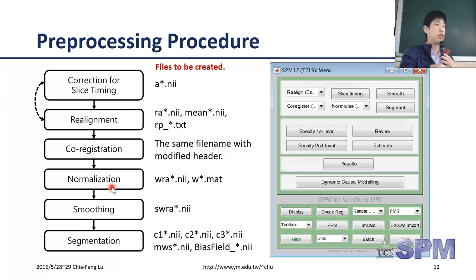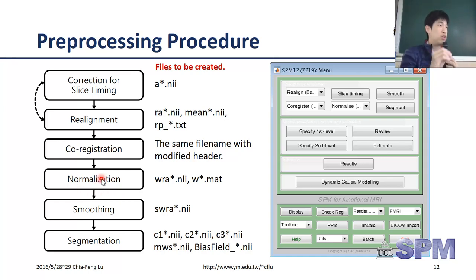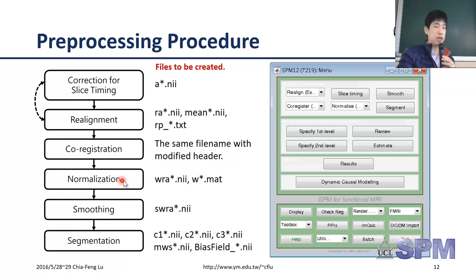The fourth step is normalization - spatial normalization - where we get rid of variation from subjects' head shape or head size. We unify the head shape and size with a standard head image. This spatial normalization step normalizes your head shape and head size to match a standard template.